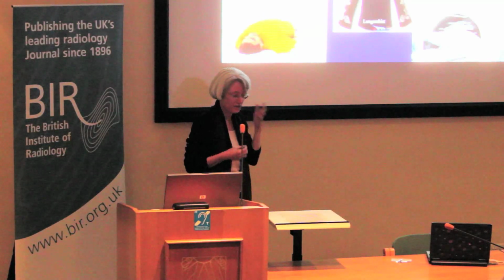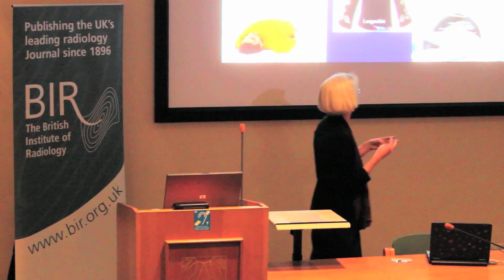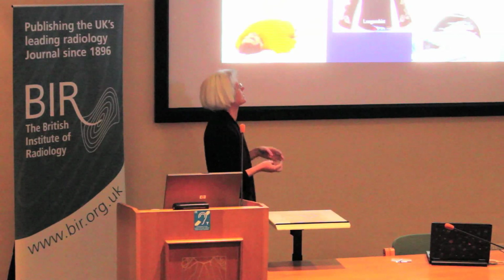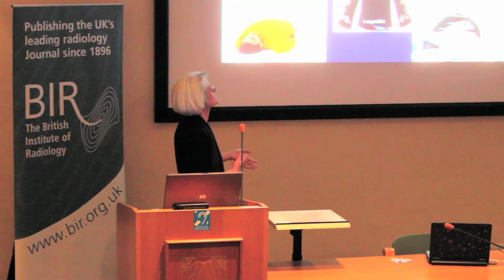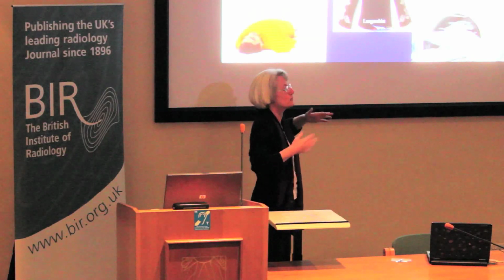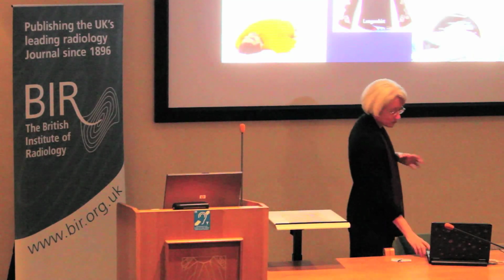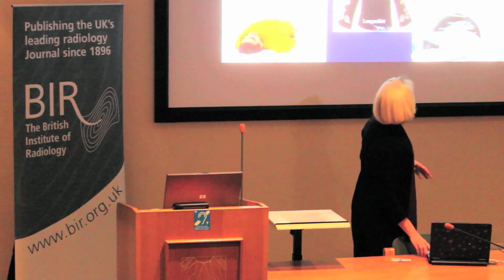Now, if I brought a radio in here and tried to tune it to Capital FM or whatever it is, it wouldn't tune in immediately, okay? It would take me several attempts of moving the aerial and so on to get it to tune in. And it's the same with RF heating. You can put somebody in the magnet 100 times in the same way and nothing will happen. And on the 101st time, that loop will tune in and they'll get burnt. And we don't want that. So you have to do all the normal things as well to prevent burning. I know everybody in this room knows it, but please make sure everybody else does.